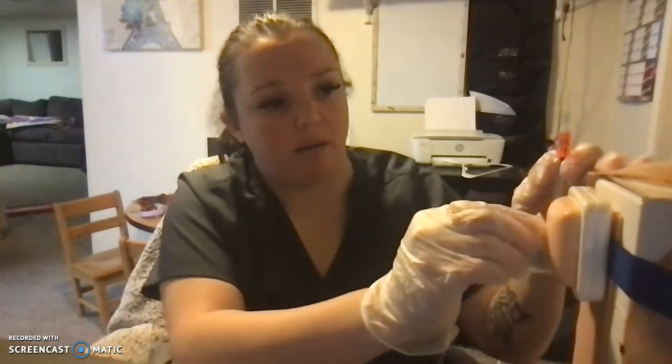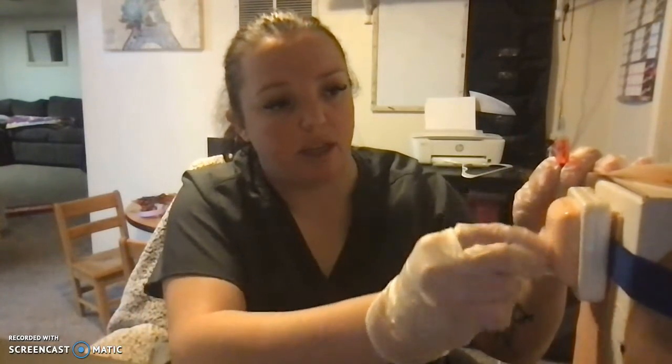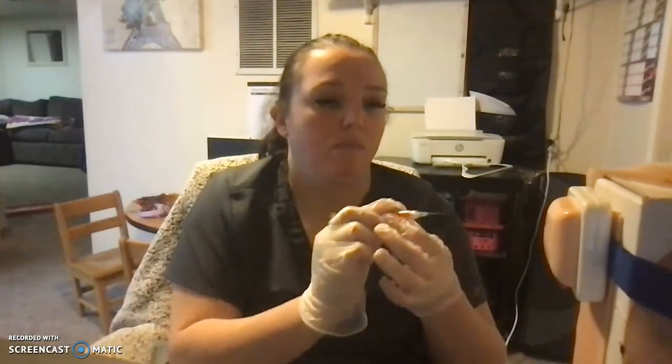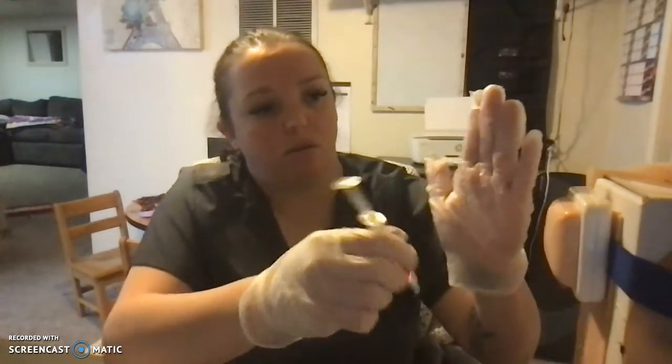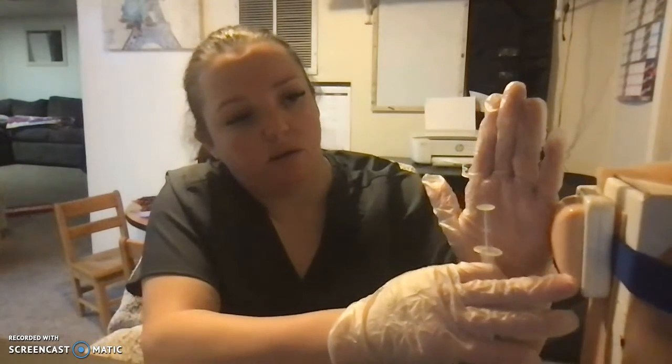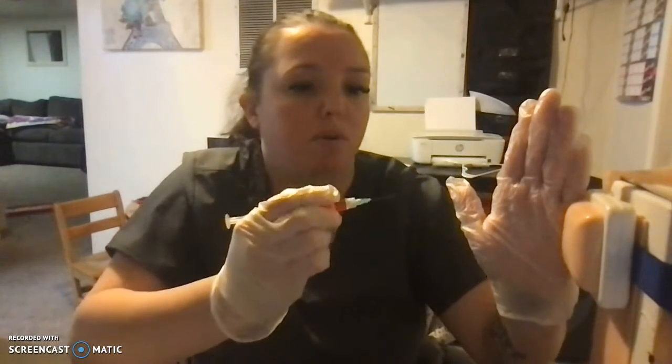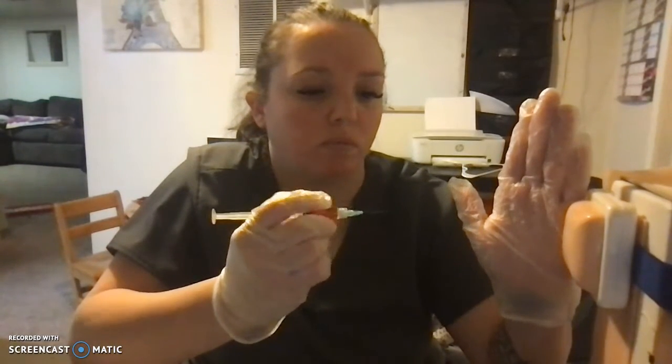areas. So then I'd grab an alcohol pad. I would clean in circular motion from the inside to the out. Allow that to dry. Grab the skin. Pull the skin tight to ensure. Bevel up. Then I would go in at a 90-degree angle. And I'd go quickly to ensure that my patient doesn't have any pain.